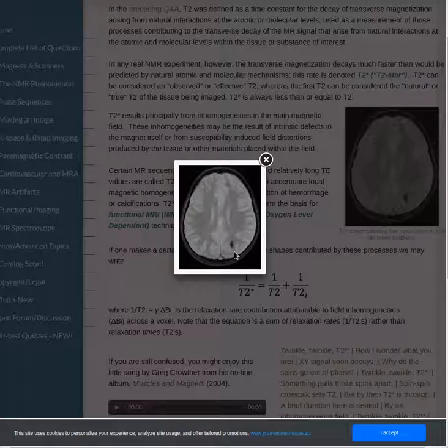And that's because there was some event that probably happened in this particular patient where blood collected over there, and because blood increases the inhomogeneities around the magnetic field, which we'll talk about in the other tutorials, don't worry about it at the moment, blood will affect the magnetic field in some way to lose signal, and so we get this contrast created because of these effects of blood, or anything in fact that disturbs the magnetic field.